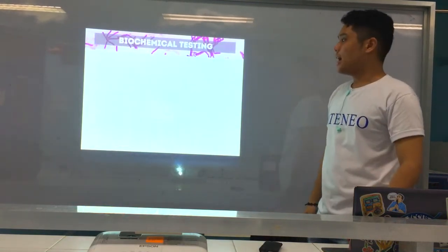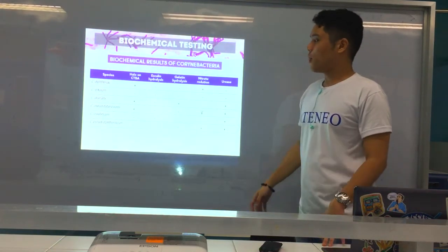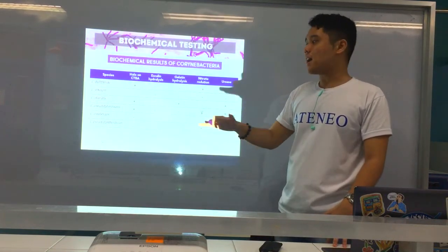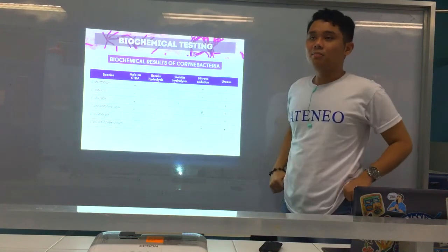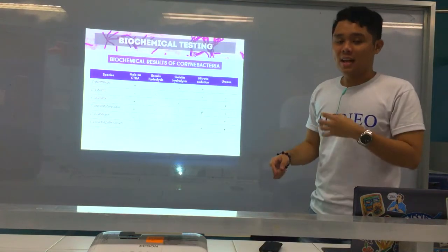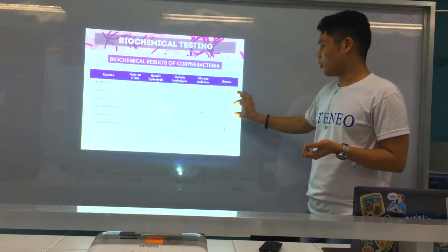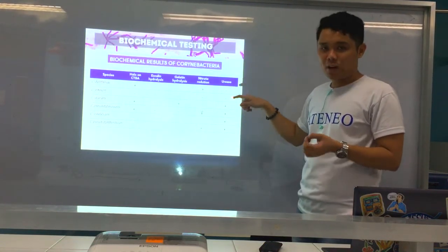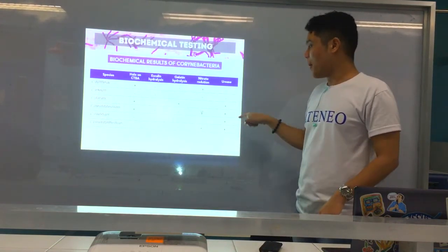Okay, alright. And summary results lang of the Corynebacteria. So as you can see, for the halo and CTBA, ang common na tulo na mo-produce ana is C. diphtheriae, ulcerans, and pseudotuberculosis. Now, sir, how do we differentiate? So, if you really want to isolate C. diphtheriae, na CTBA halo, you use urease. As you can see, siya rin negative. Positive ang ulcerans and pseudo-TB, but ang diphtheriae is negative. Really very characteristic sa C. diphtheriae, it's urease negative. Compared naman sa other two.